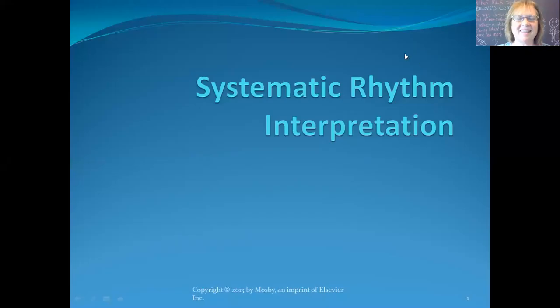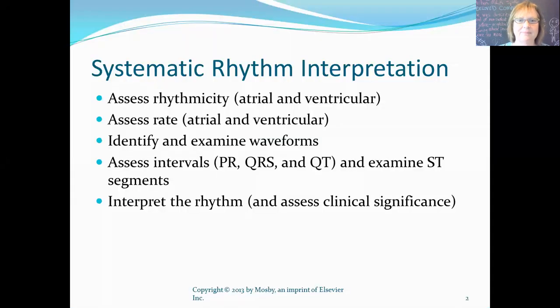Hi everyone. I thought I would just make a short recording, and I hope it'll be fairly short, that goes over the systematic rhythm interpretation method. And Leslie went over this with you in class last week, but I just want you to have an opportunity to either see it if you weren't in class last week or to refresh your memory if you were and you want to go back and look at it again.